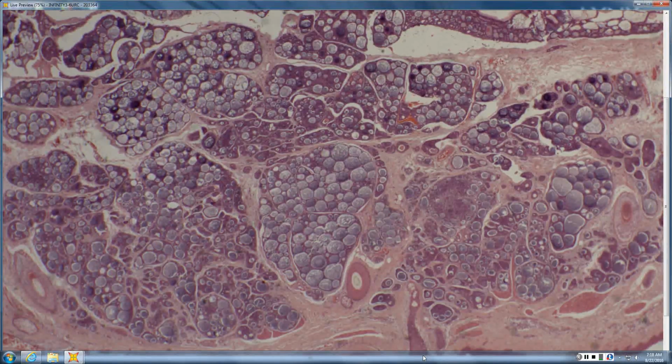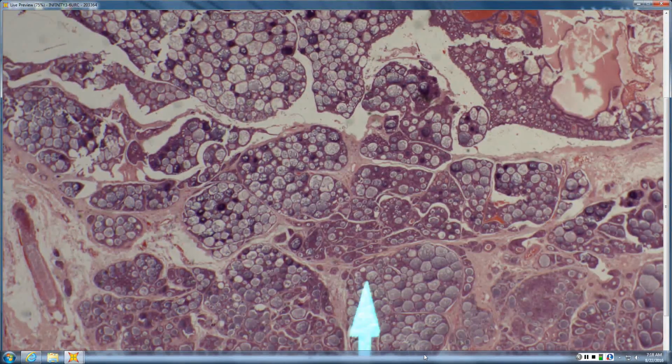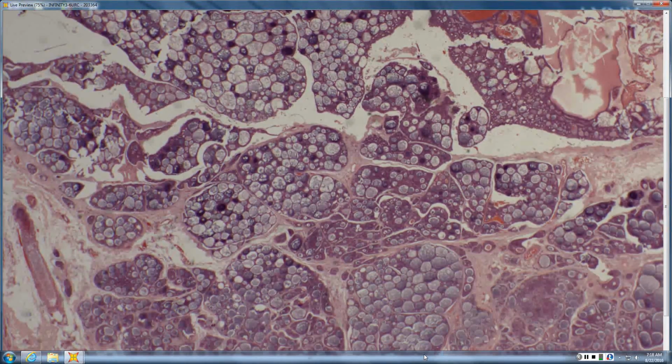This is adenoid cystic carcinoma. This is another one that can actually be found on internal things, particularly like salivary gland neoplasms and whatnot, but it also can just be primary to the skin. This is a very unique pattern, has this sort of cribriform adenoid pattern with this very bluish sort of mucin within. And so really good for adenoid cystic carcinoma.